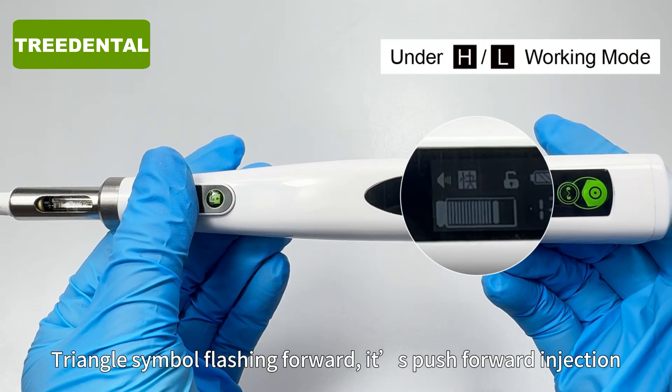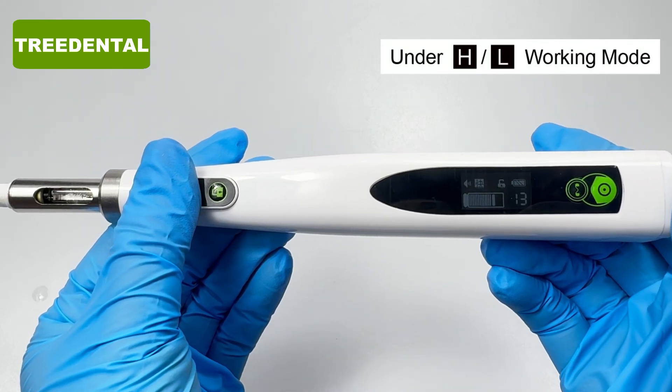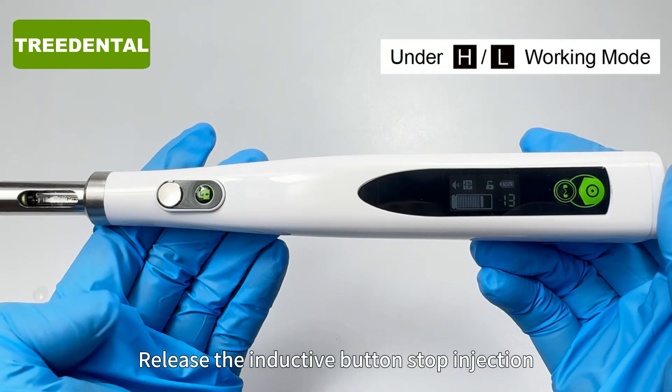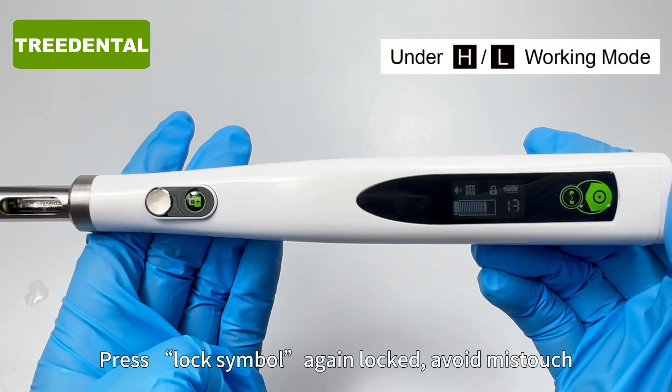The triangle symbol flashing forward indicates it is pushing forward for injection. Release the inductive button to stop injection. Press the lock symbol again to lock and avoid mis-touch.